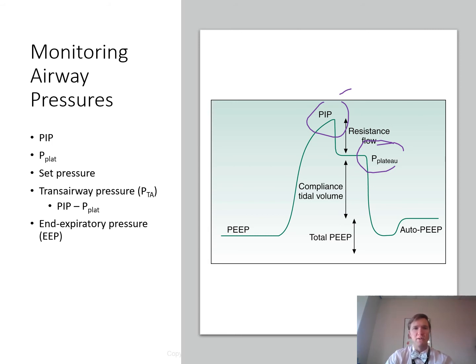All right, mean airway pressure. Usually the ventilator will display what their mean airway pressure is. They will automatically calculate this, right? But mean airway pressure is affected by PEEP, or end expiratory pressure, and what's called the duty cycle.